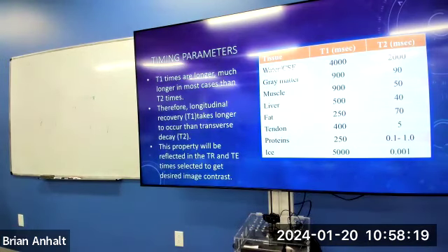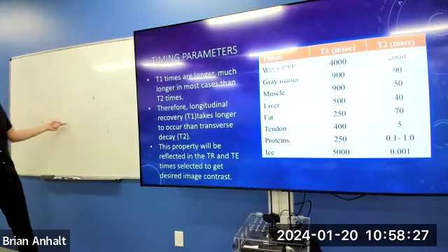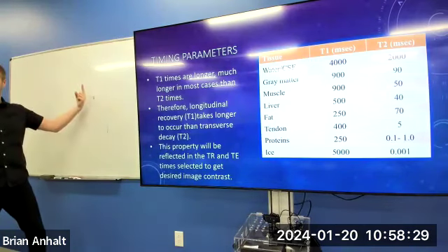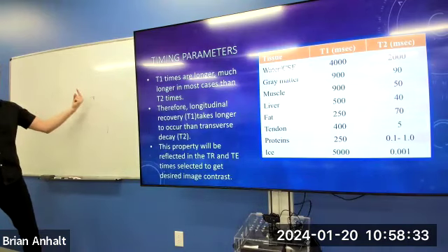Right? So we're waiting 4,000 milliseconds. At 4,000 milliseconds after a 90-degree excitation pulse, water recovered its longitudinal component to 63%. That's all that is saying.